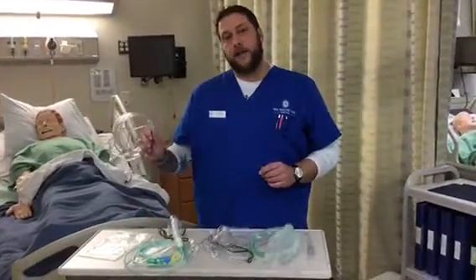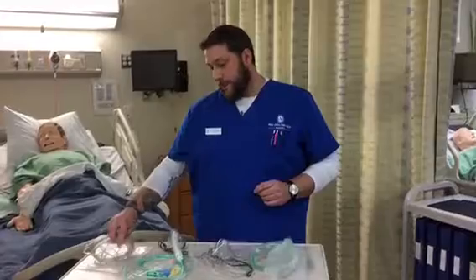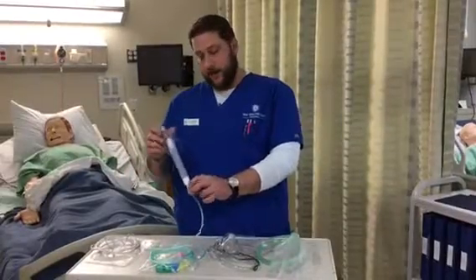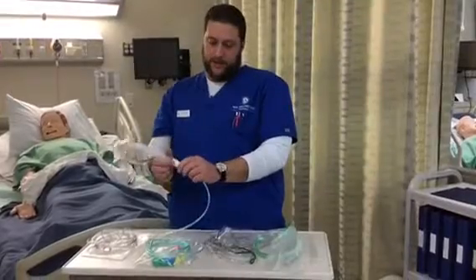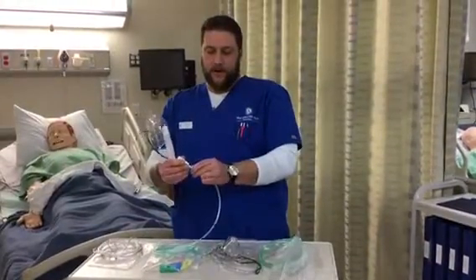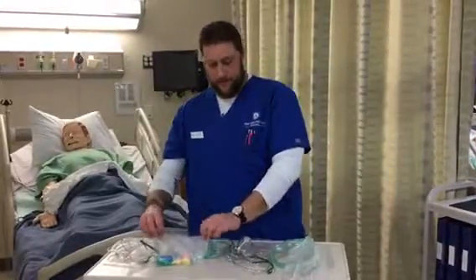This is a nasal cannula. It's used for 2 liters per minute to 6 liters per minute of low flow oxygen. If they were ordered, such as COPD, they would use this, which is a Venturi mask, which can be adjusted. It fits over the head, behind the ears, and these interchangeable pieces give an exact amount of delivered air. And there's multiple pieces that could be inserted.